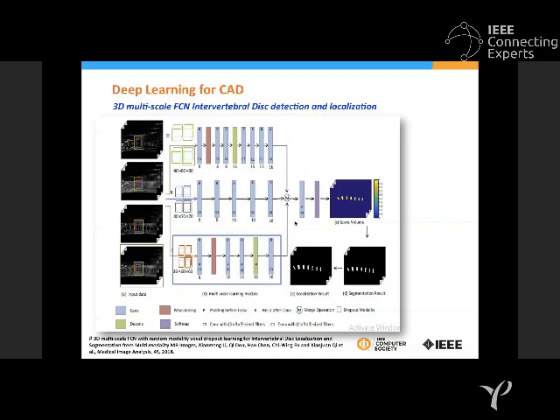If we do the analysis, or if you extract the patterns in multiple scales, it actually prioritizes the features in all the scales, and then supplies them to the network. That is very good for the vertebra, because each vertebra has different responses in terms of the scales, the resolution, and the structure of the vertebra. So the variation in a vertebra is huge, and this type of network helps us to extract the features in a very efficient way.